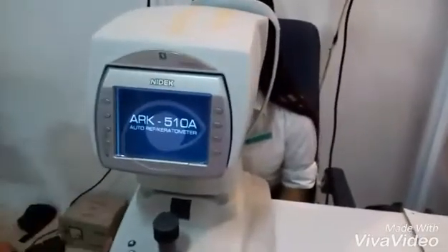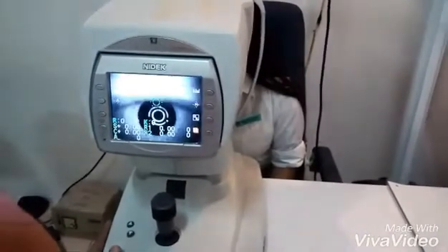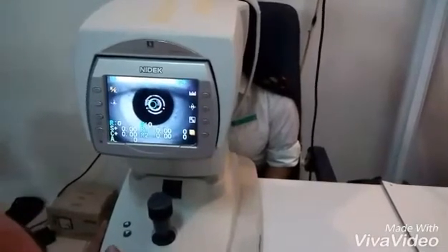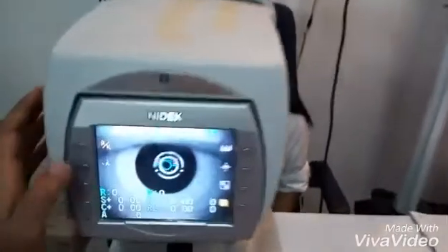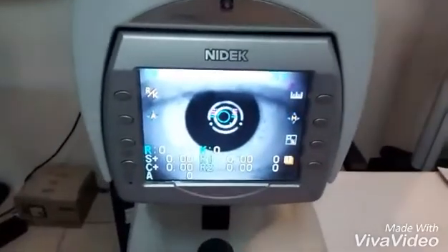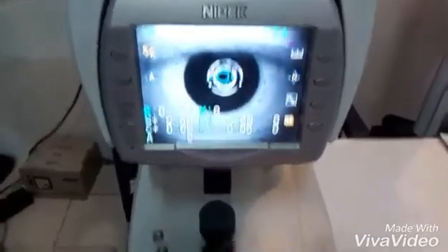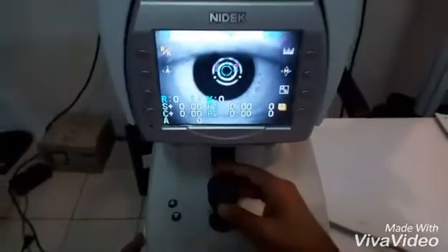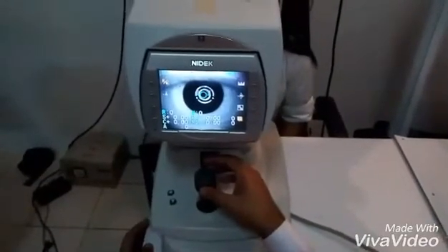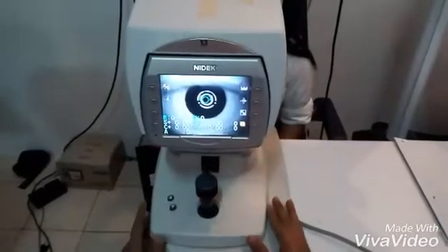Once the machine is on, the screen will appear. The examiner will keep the menu on automated mode. With the help of the joystick, the examiner will move the instrument up and down in order to coincide the circle with the pupillary margin and focus the image on the screen.